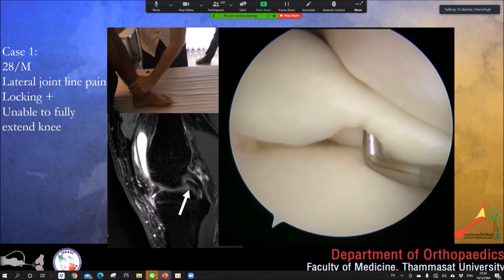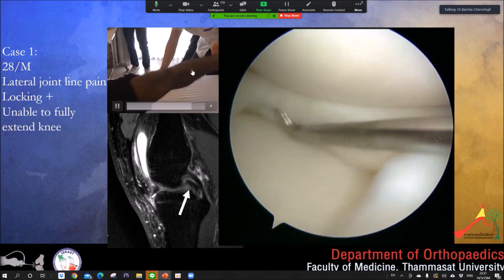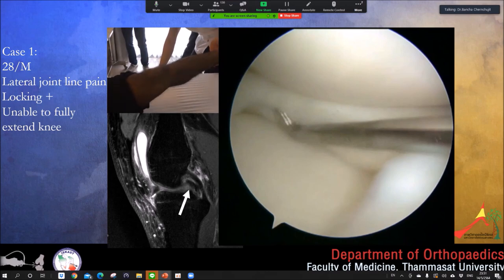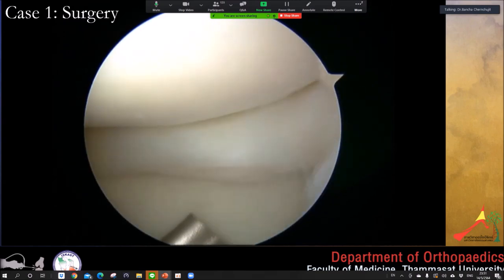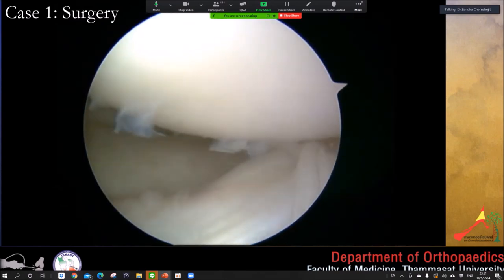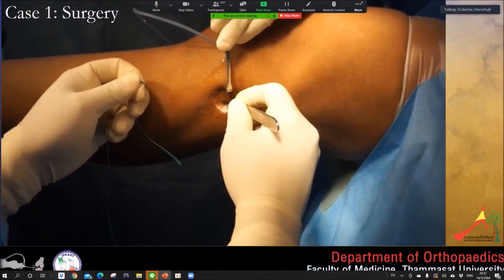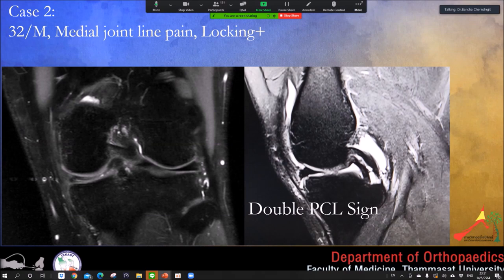Case 1: A 28-year-old with a locked lateral meniscus bucket handle for six months, presenting with flexion contracture and severe pain. I tried to reduce the meniscus — it was very difficult because it was the lateral side and I could not open the joint space. Using inside-out sutures, I slowly reduced the meniscus back, tied the knots, and achieved reduction. One year after surgery the patient was very happy and the meniscus healed very nicely.